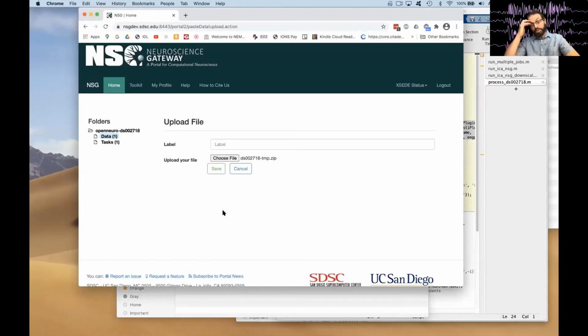I've uploaded up to 5 gigabytes. 5 gigabytes on my laptop takes about 2 hours. But again, my bandwidth is just home, so it's not ideal. If you're at the university, it's probably faster.